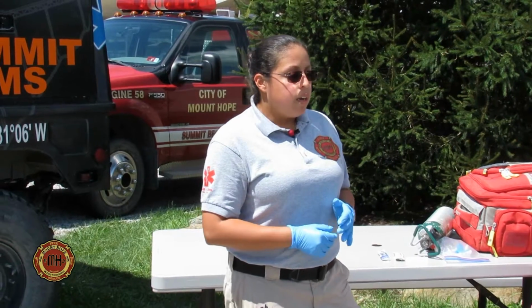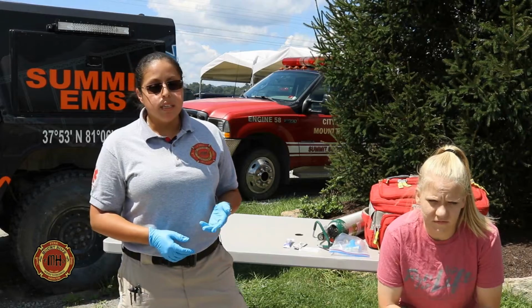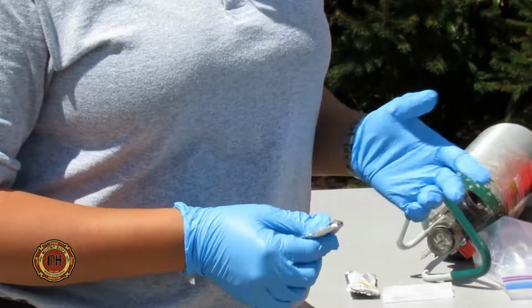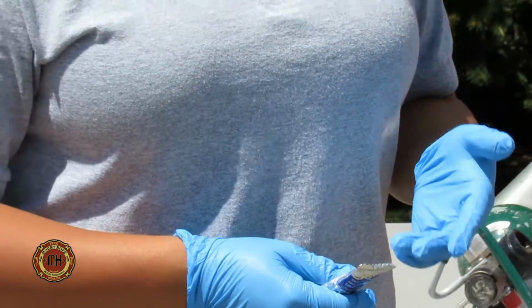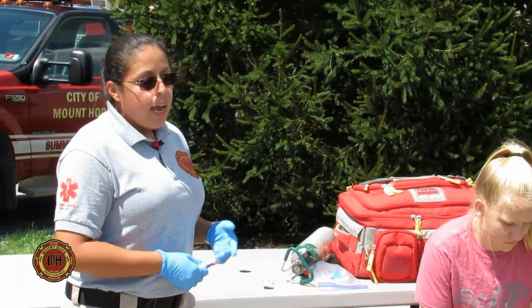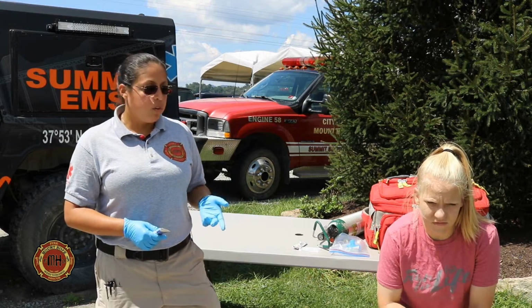If you're having moderate distress and you have a heart rate less than 130, you want to do your albuterol. You're going to need 5 milligrams of albuterol with Atrovent, and that creates your duoneb. Your Atrovent dose is 0.5 milligrams. You're going to have your oxygen at 8 to 10 liters per minute. And if Atrovent is contraindicated, then you're just going to do the albuterol.